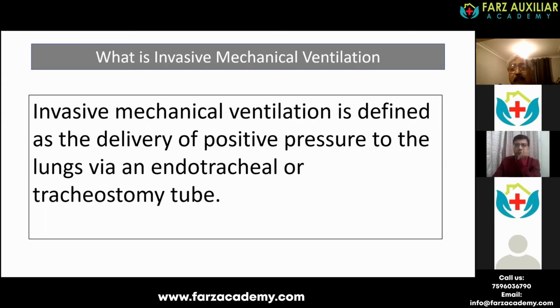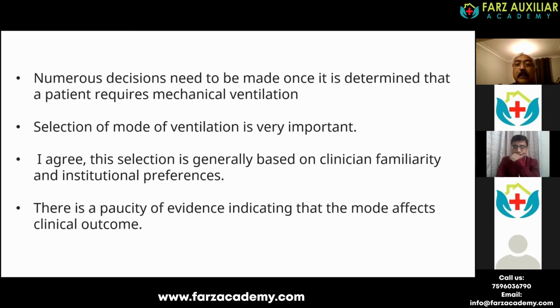Why do you need mechanical ventilation? You are just pushing a mixture of air plus gases, which is normally oxygen, into the lung via an endotracheal tube or tracheostomy tube. Then we call it mechanical ventilation. We all know that when you have a problem with the patients, we need to ventilate them, and we have to consider many things while we are doing ventilation.